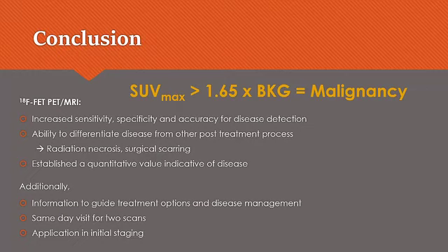From this trial, 18F FET PET-MRI not only has demonstrated its utility for the assessment of post-treatment changes in primary or secondary brain malignancies, but also suggests a place for its use in initial staging.